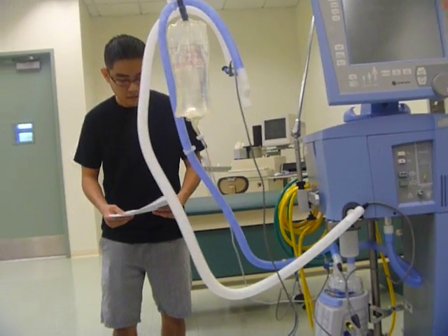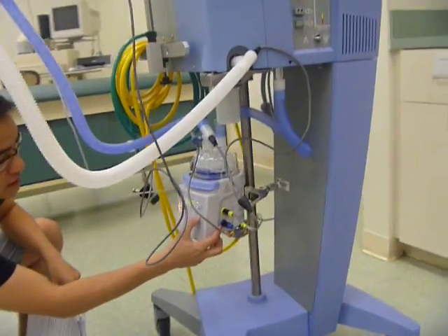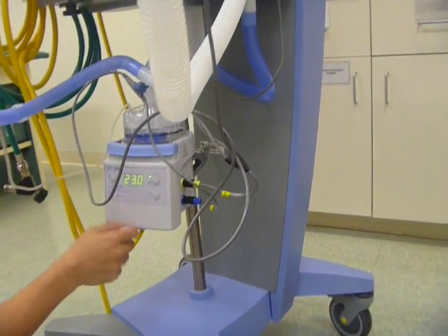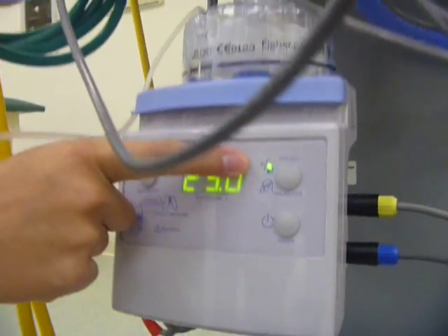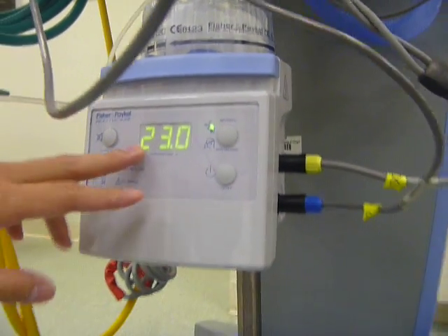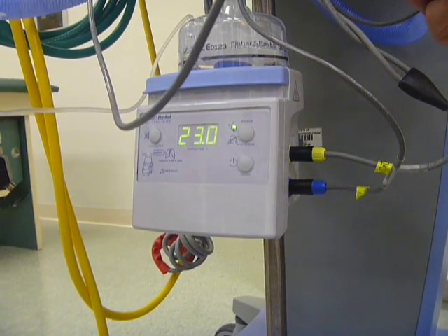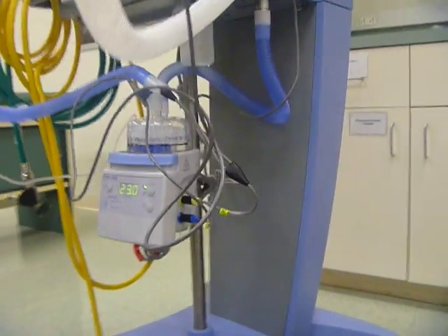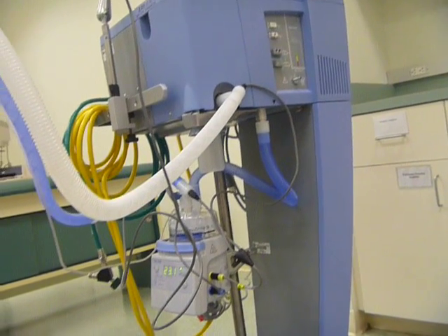Okay, and that tells you to turn on the humidifier. On-off button — you want to press that. And you want this to be on invasive, because that's going into the patient. It's already selected — you see the light. So the temperature says 23 right now. With it plugged in, it's going to go up to 39. So we need to pre-set this before we set it up for the patient. We can't set this up until it warms up.